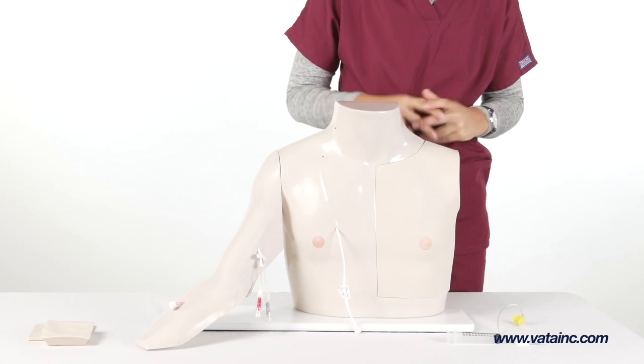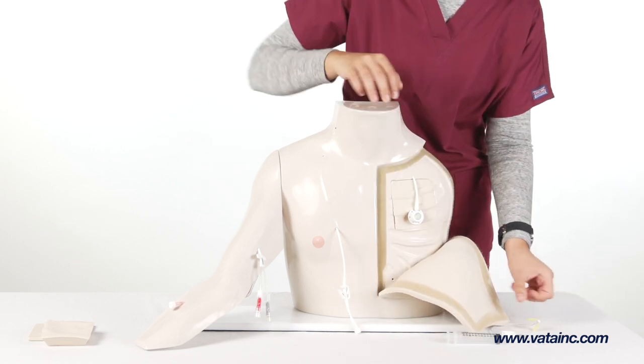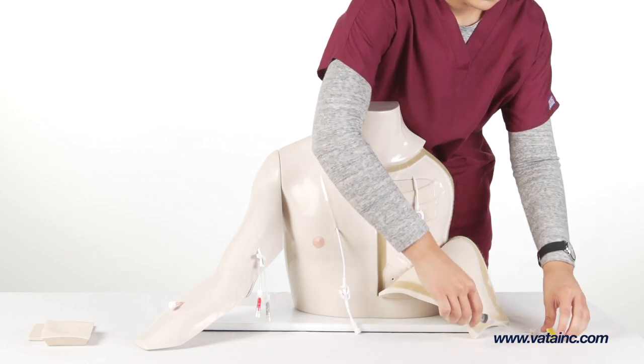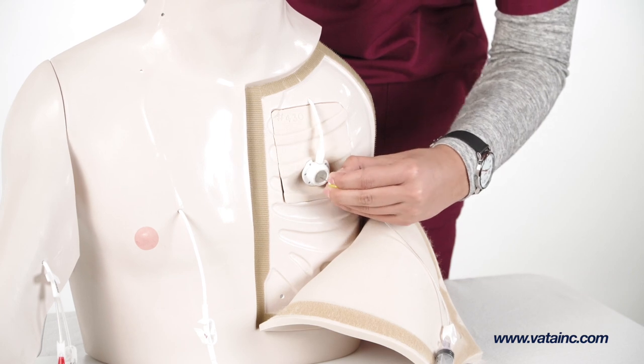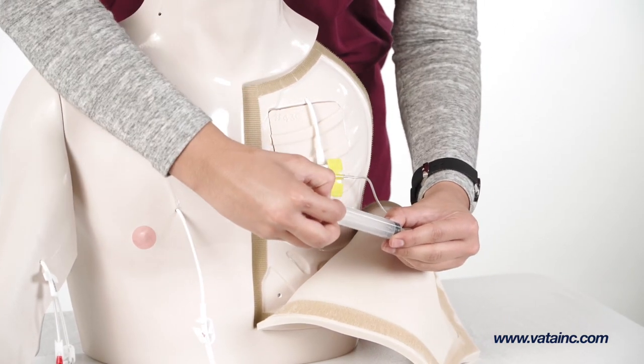Next, remove the chest tissue flap on the left side of the chest, attach a Huber needle to a syringe and access the port. Repeat the procedure used to prime the tunneled central venous catheter until simulated blood is visible in the syringe.